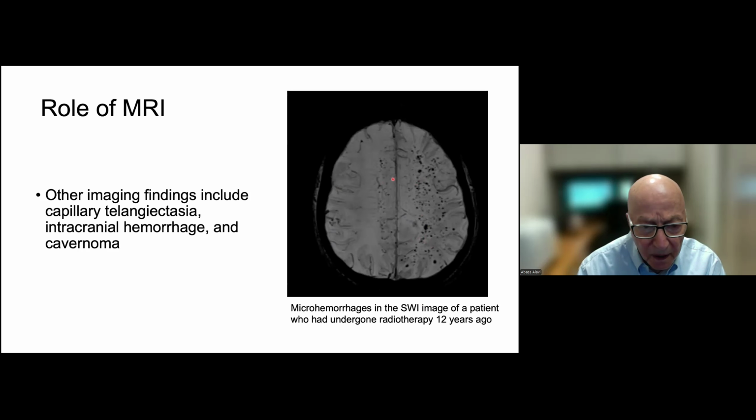body. So we really are extremely interested in looking at both FDG as well as sodium fluoride in head and neck cancers, as well as patients who are treated for their breast cancer or left lower lung cancer, to detect evidence for atherosclerosis and try to minimize that in the future.